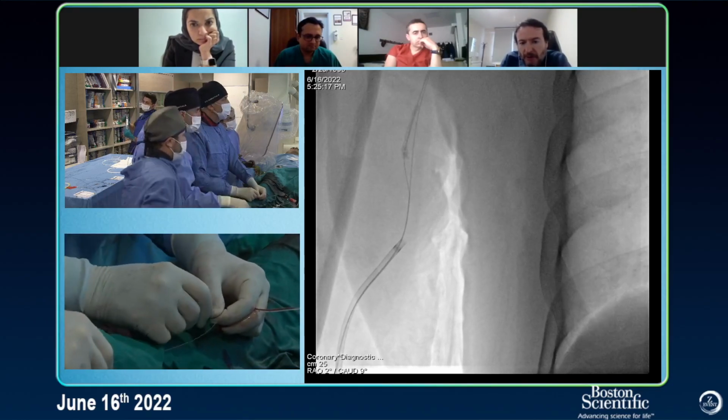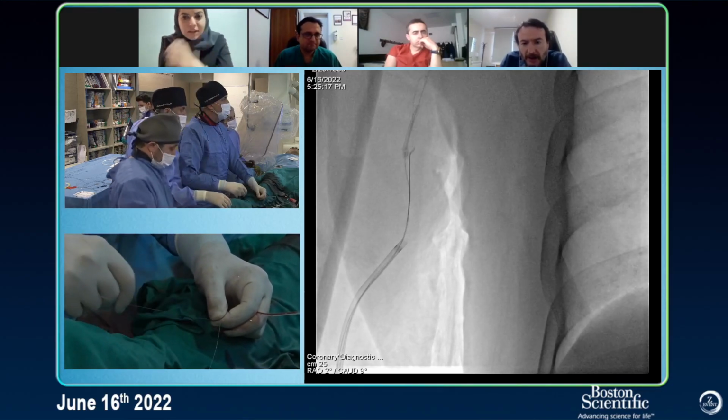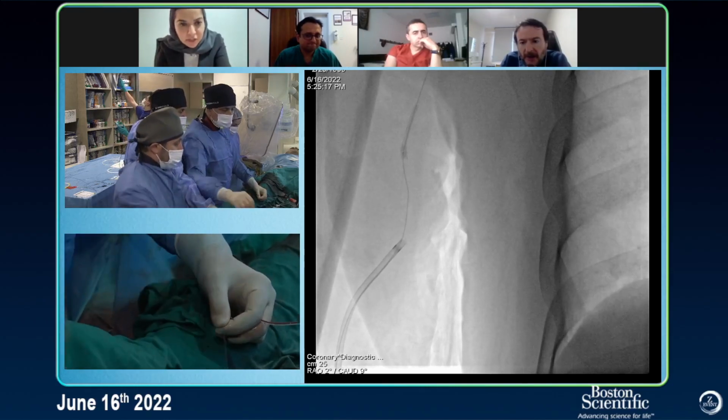This can happen also to a very renowned operator. As you see, stuck on the wire. That's a good thing. All right, so let's have a snare.